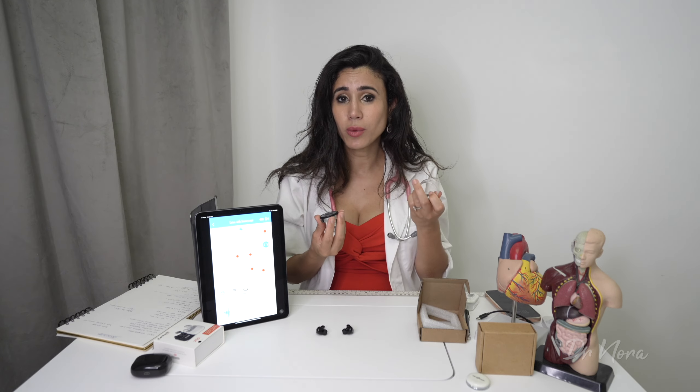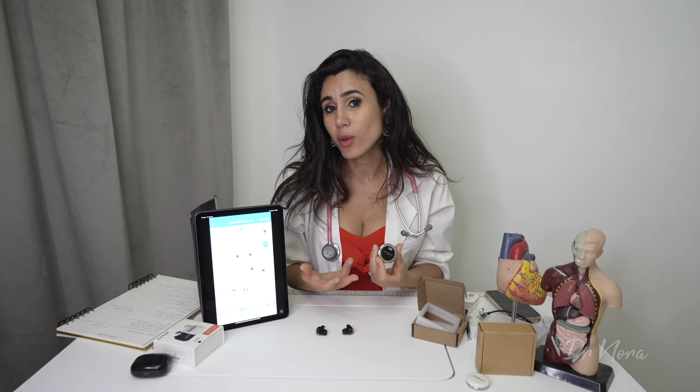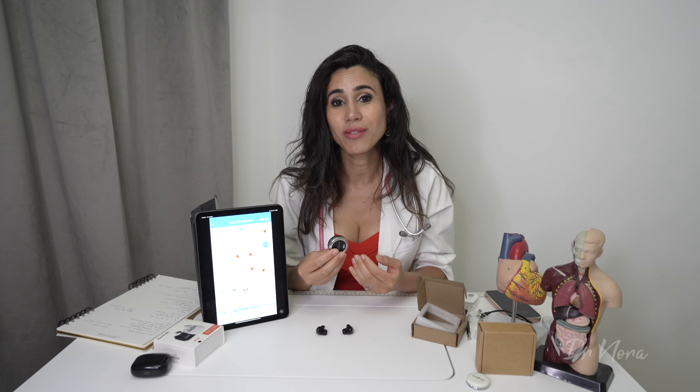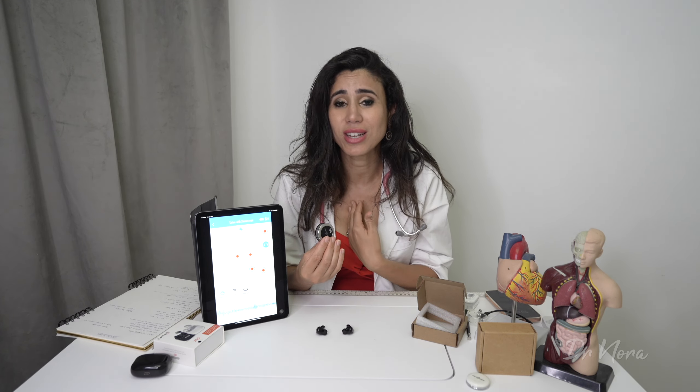I've been using the Stemoscope for about a week now. It is really simple to use — no tubing around your neck causing strain. Just pull it out of your pocket or attach it to a lanyard. Sound quality is quite comparable to my Littmann Classic 3. The amplification feature is very useful on a busy or noisy ward, and for those who are hard of hearing. The telehealth live-stream feature is great in principle, though limited by patients not knowing where or how to place it on their chest.